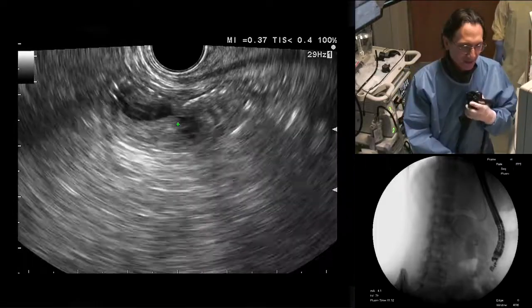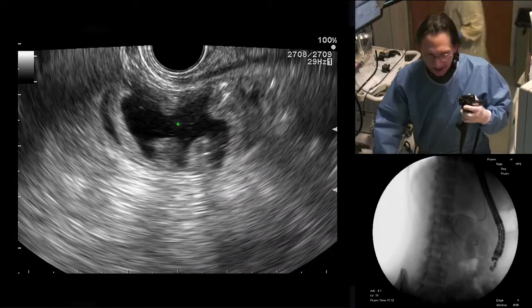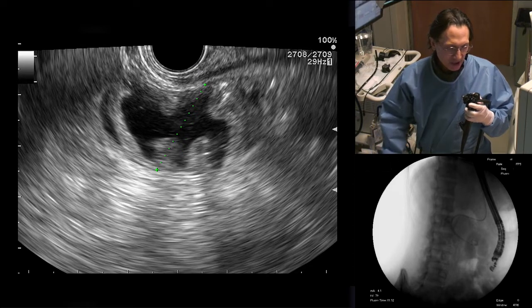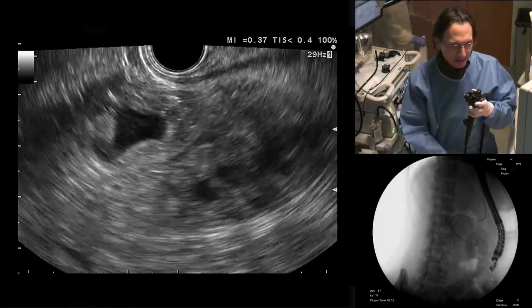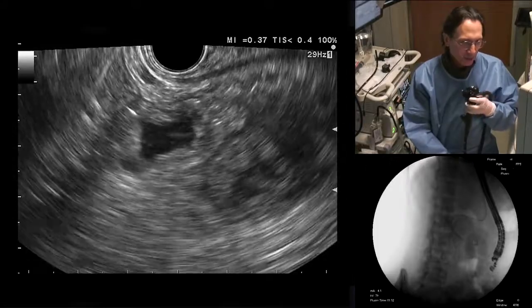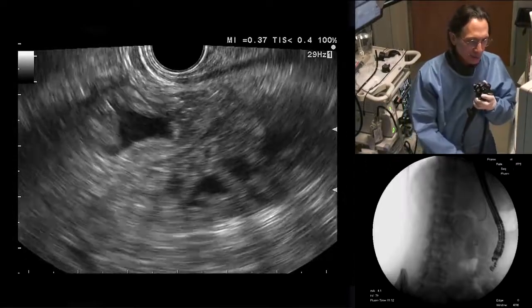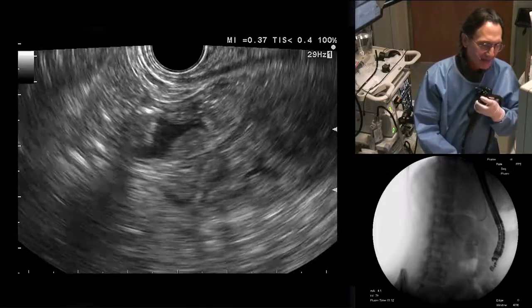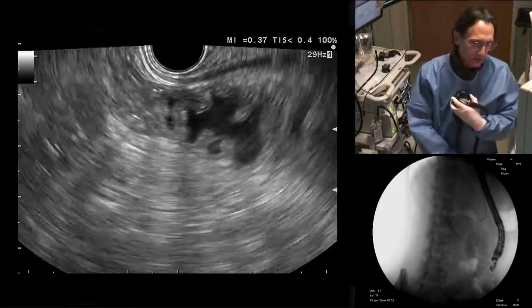Now you see it filling up very nicely with water. So let's take a look here. We'll just freeze our image. And you see we don't have a lot of room, do we? We're looking at just 2 centimeters. And you need to advance the AXIOS sheath at least 3 centimeters if you're going to release the distal flange by pulling back the sheath. So if you don't have that room, then you need to use the alternative technique of advancing the AXIOS out of the sheath versus retracting the sheath. That's what we're going to have to do today.